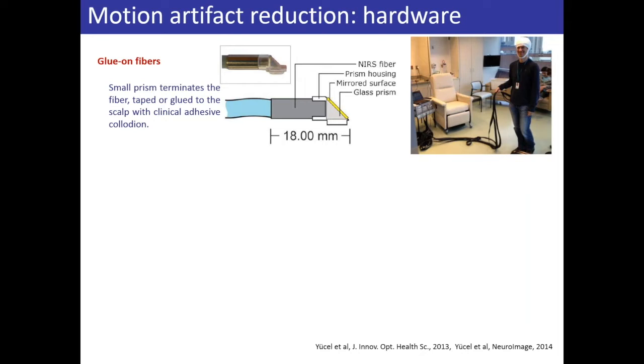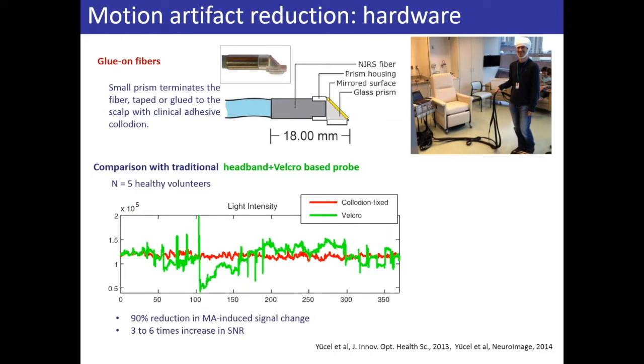This process is regularly done to glue EEG electrodes on the head at MGH. So we followed that up. And in a follow-up study, we systematically compared the signal quality of fNIRS channels using glue-on fibers versus Velcro-based fibers, because at the time we were using Velcro-based fibers. Right now we are using EEG caps. So on one subject, for instance, on one hemisphere, we glued on fibers, and on the other hemisphere, we put on a Velcro-based fiber or probe. And this figure is showing a raw signal on 2 channels, one collodion fixed, which is this red channel here, and then one from the Velcro probe, which is this green line.